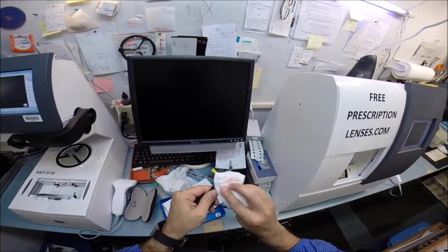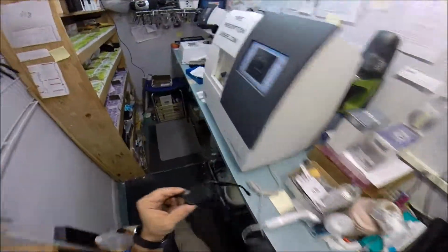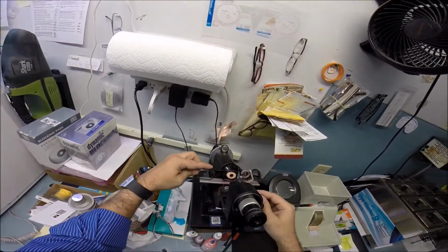Dry the lens too. Oop, did I smear your little red dot? Let me darken that for you. I need the paperwork again too. Even though I know it's 180, I just need the white background in just a moment. So let's turn that wheel to 180, which is 0. Put the left lens in.